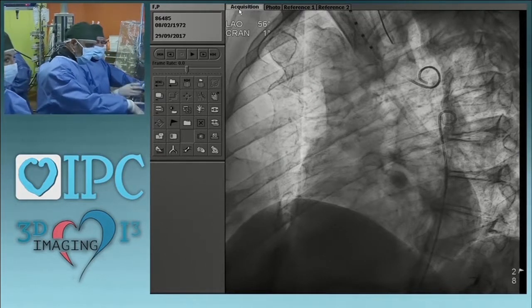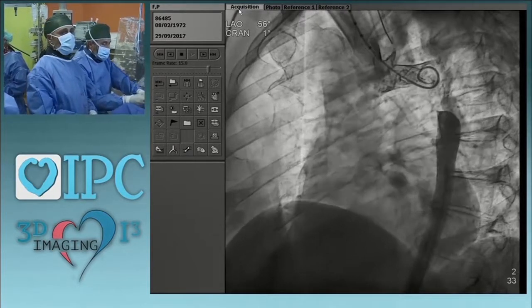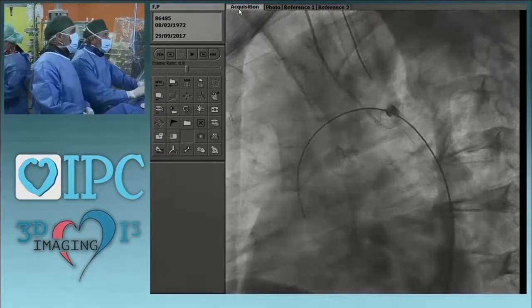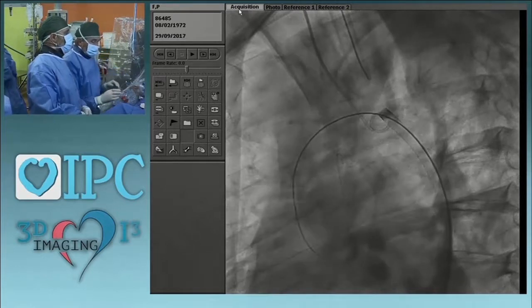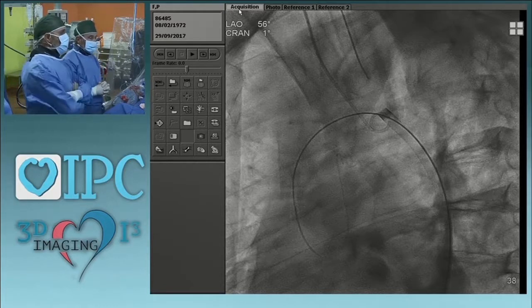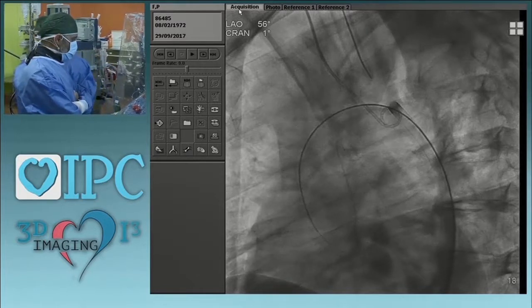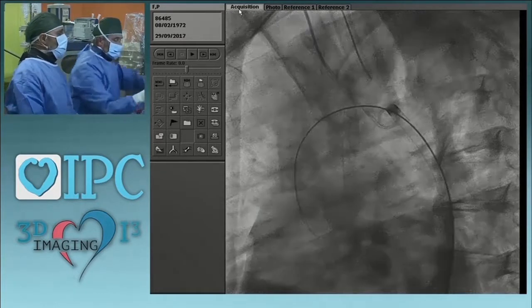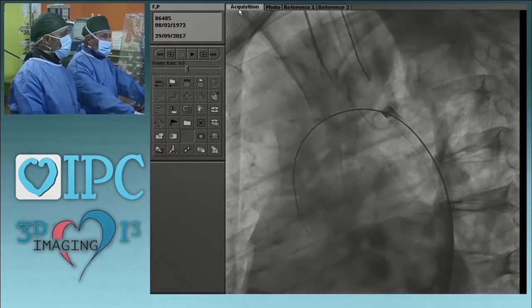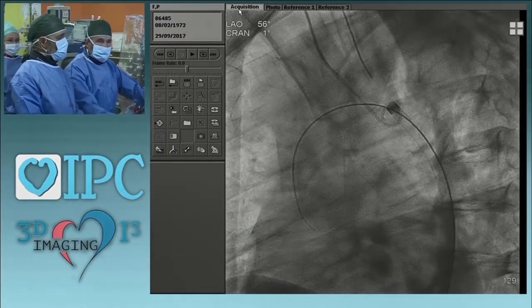So please go ahead with questions and comments. So Mario and Gianfranco, what are your options in Italy? Obviously, I'm assuming you're planning to place a covered stent with near interruption. And so do you have certain options in the United States? We don't have so many options. So you want to comment on the various options for a covered stent, assuming it's going to be a covered stent given the near interruption and the patient's age? Yeah. We do have two options here in Italy, that are the CP covered stent and the Bentley stent. These are the two options we have currently available in Italy.